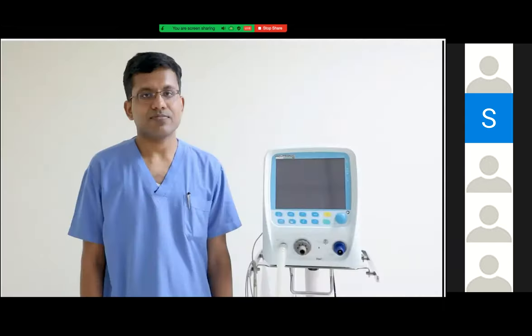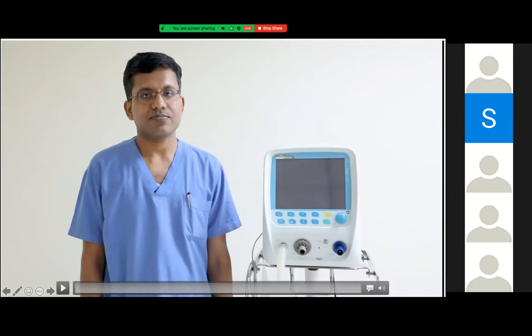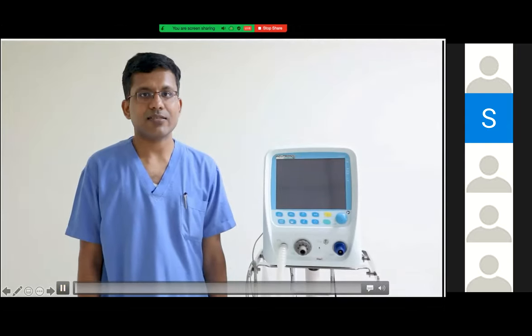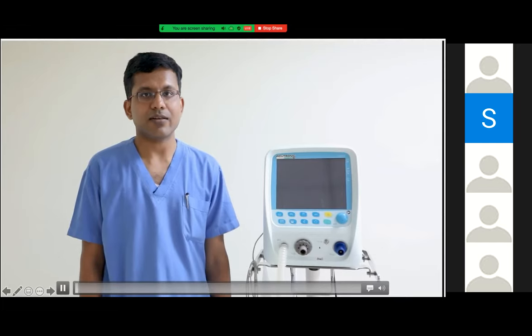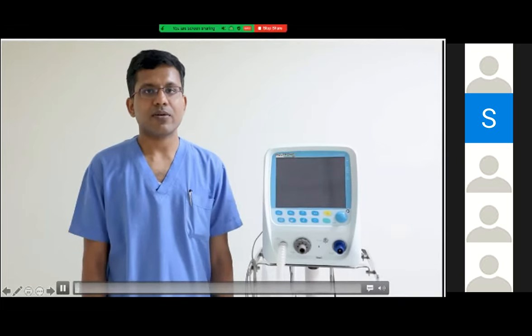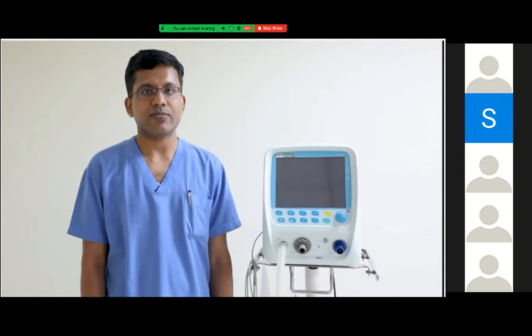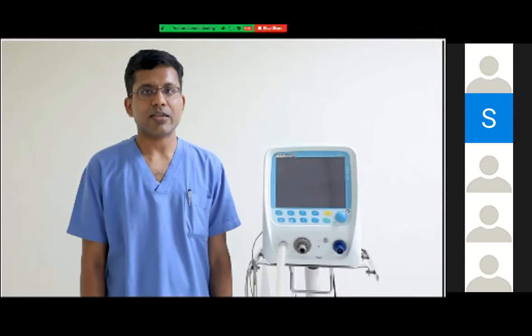In this video, I will be showing you the parts of the mechanical ventilator. For the purpose of demonstration, we are using the Acutronic ventilator from Fabian. We are not promoting any ventilator — this is only for the purpose of demonstration.